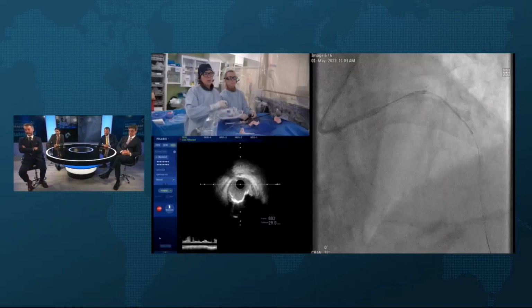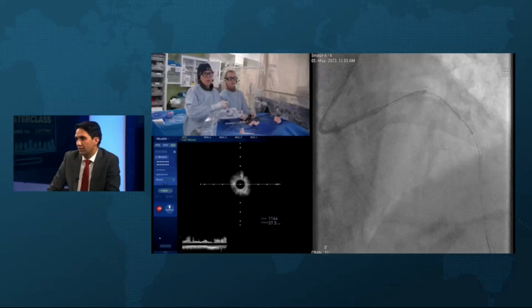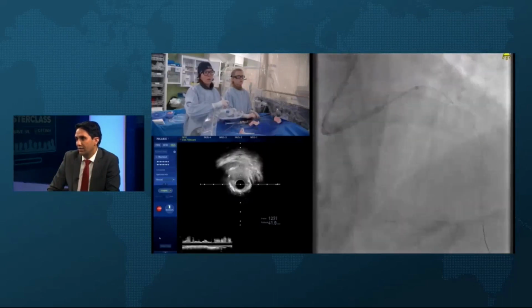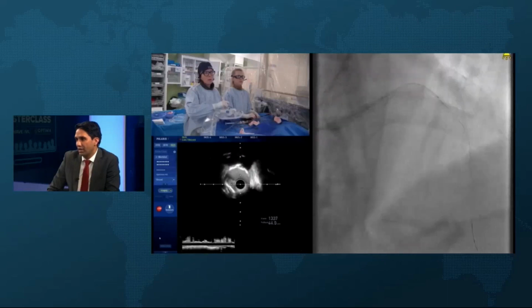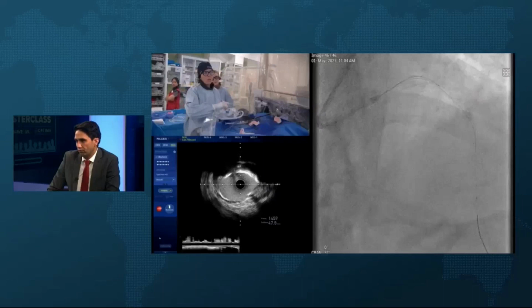Which, I mean, you called the ball right away. But like we were saying before, look at all these different fracture morphologies within a single lesion. You have eccentric calcium, you have nodular calcification, you have 360 degrees. I mean, there's really everything in here. Nice fractures. And look at the movement of the plates there with all the fractures.